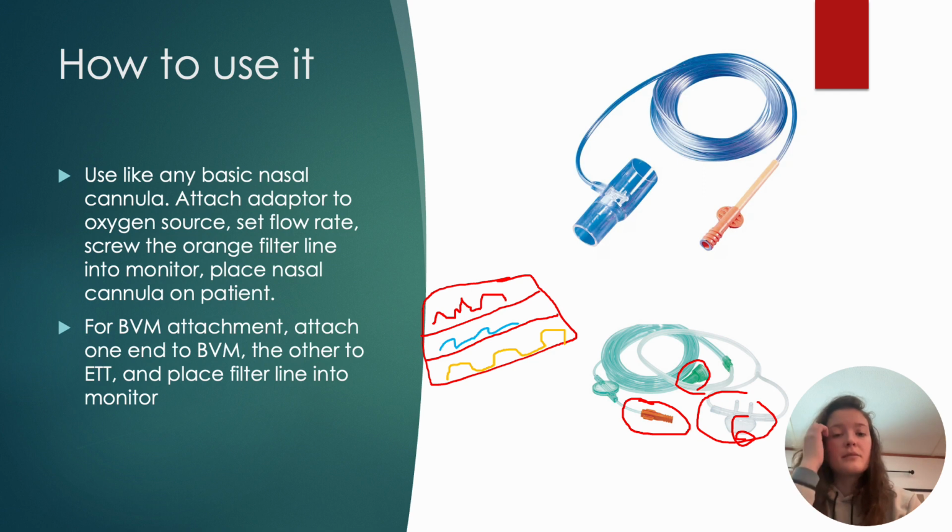Like I said, this is something that should be used on every patient with difficulty breathing, cardiac arrest. I think it's something that is a good quantitative thing to show how well your patient is breathing.